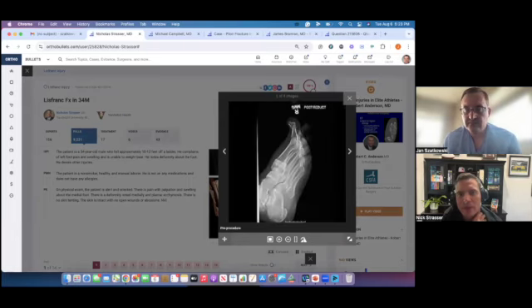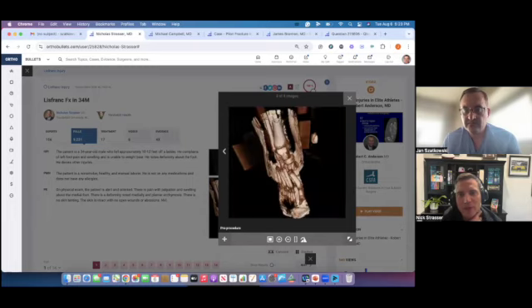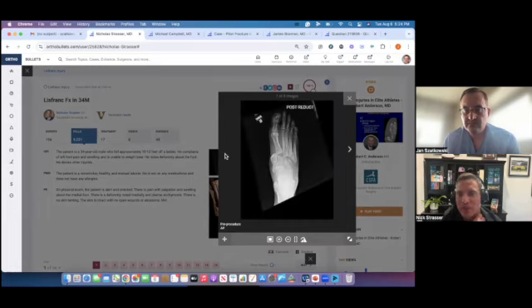So, these are his initial presenting x-rays. This is what I got called about by the resident, his post-reduction x-rays and CT scan. Obviously there was an attempt at reduction. What I see when I look at the x-ray is basically a primarily ligamentous homolateral Lisfranc dislocation. Maybe a small fleck sign off the base of the second near the medial cuneiform, but otherwise it looks mostly ligamentous. I think the CT scan confirmed that, if I'm not mistaken.